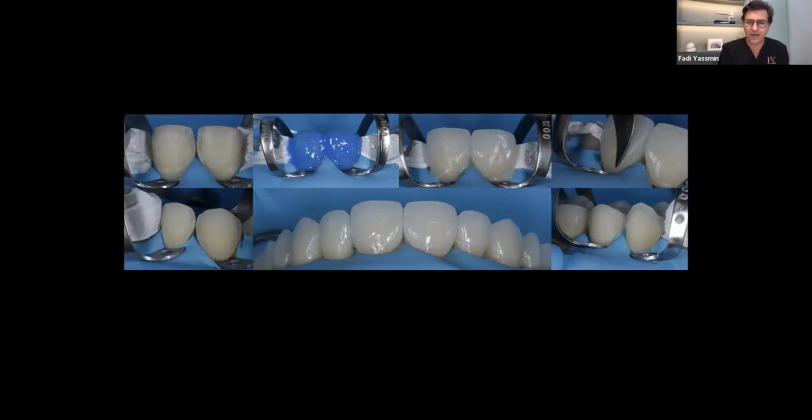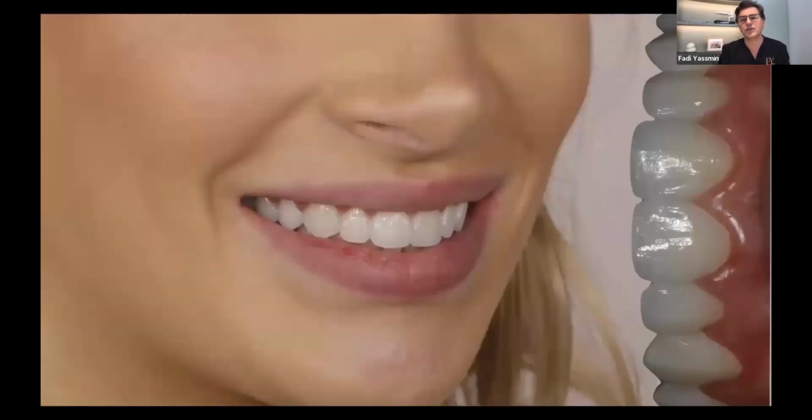So it's not always layered ceramic. In fact, in a lot of my cases where protocols are followed and provided the substrates are an even color, I'm using natural biocopies of HD files, milled on a fine tooling to achieve these results.